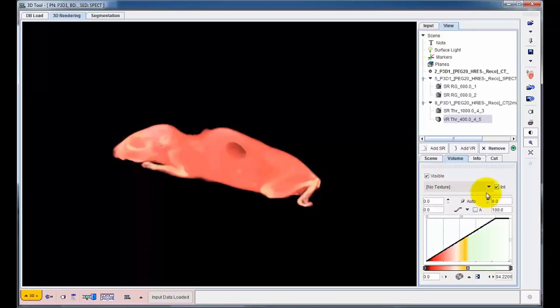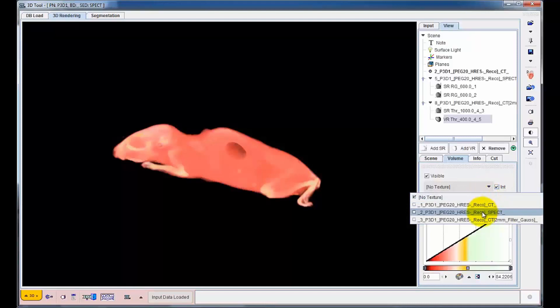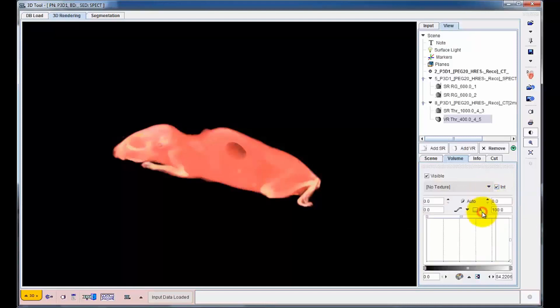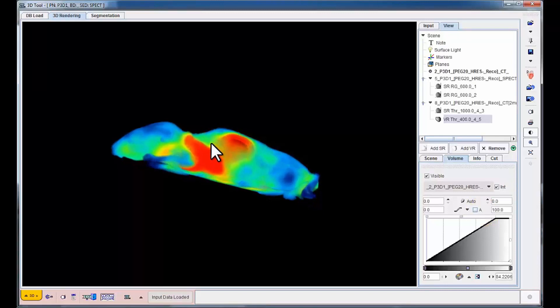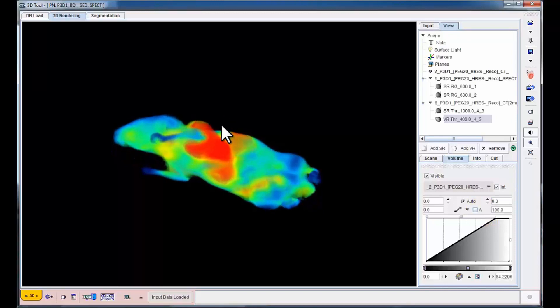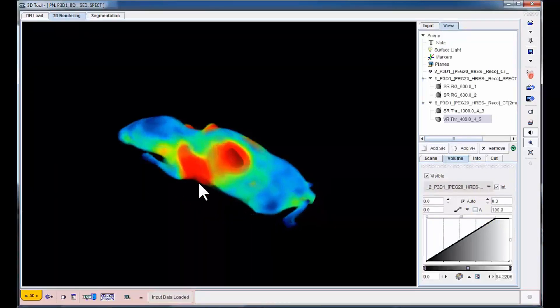Functional information is now added to the volume rendering by selecting the SPECT image as a texture. In the resulting rendering, it becomes clear which part of the tumor shows the highest SPECT tracer uptake.